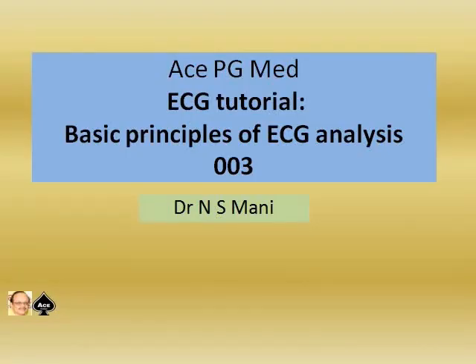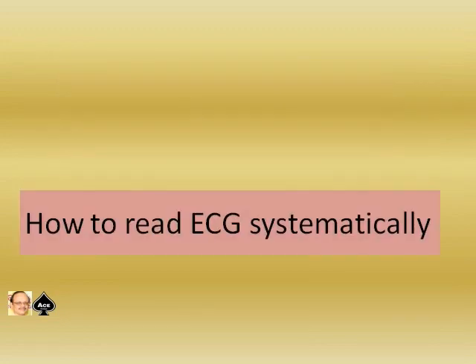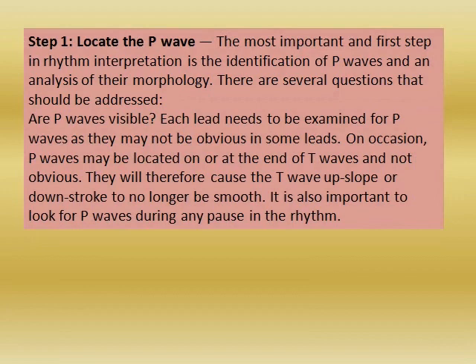This is the third part of the series of video presentations on basic principles of ECG analysis. I am Dr. N.S. Mani, Professor of Pediatrics from India. And in this video session, I am going to tell you how to read the ECG systematically.